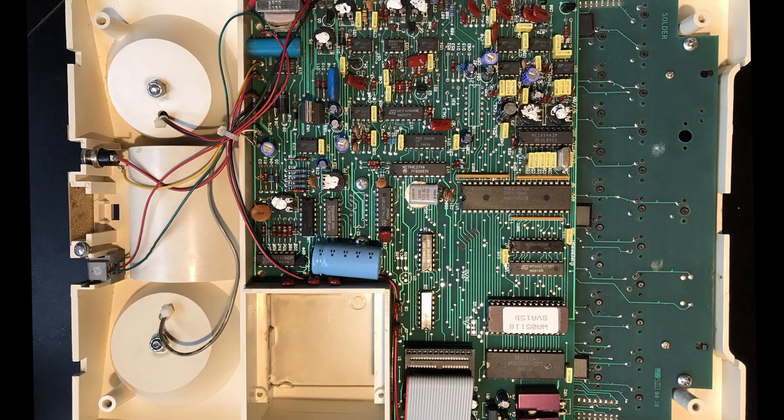While getting the unit cleaned up I took the four screws off the bottom and took a look inside. There is a NEC 8-bit microprocessor running the unit, as well as a socketed EEPROM visible in the lower right labeled WA05118. I believe this is what stores the customer-specific information — in this case it would have been State of Washington — and you can see when the unit boots up it displays Washington and an ID number. In the center you can see where the keyboard connects onto the main board.